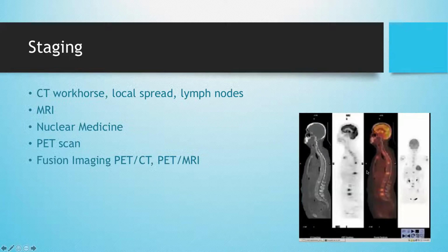It improves your anatomic precision, and you're better able to localize where the lesions are found. That's how fusion imaging has come in, and that's one of the more recent things that has developed in radiology, around 2008. Unfortunately, PET MR is so expensive that it hasn't really taken off, and it doesn't look likely to, not in the near future anyway, because most places cannot afford it.